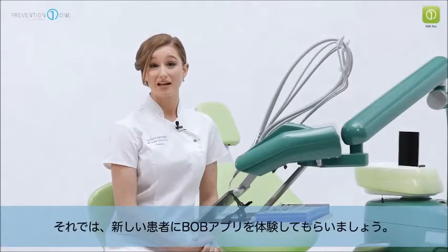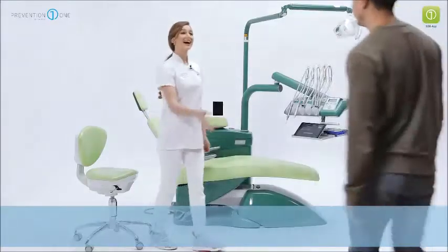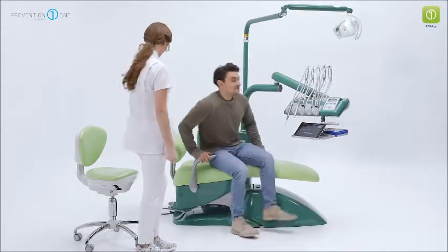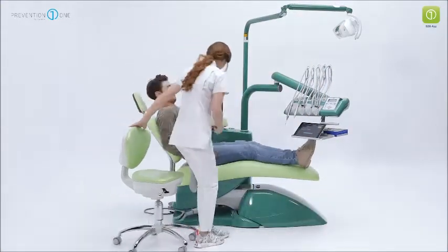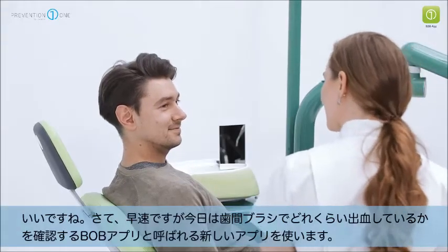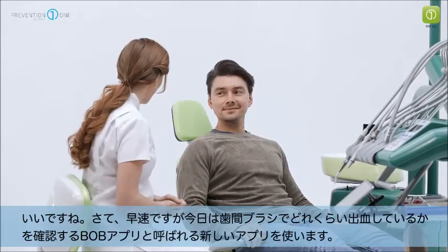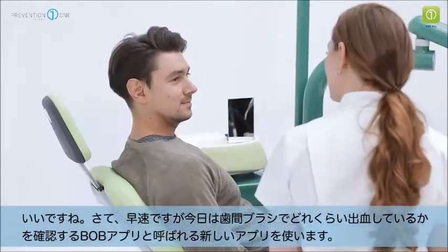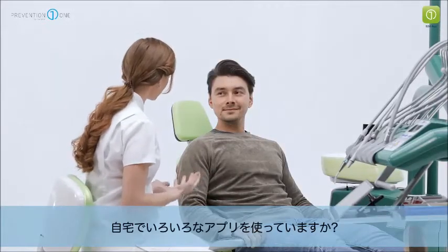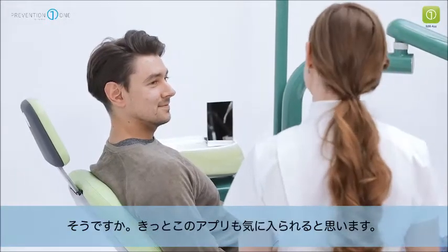So now I'm going to be calling in my new patient to start the new Bob app experience. Hi John, nice to meet you, please come and take a seat. How are you today? It's lovely to have you here and we're going to be using a new app with you today called the Bob app, which stands for Bleeding on Interdental Brushing. So we have gamified dentistry a little bit. Do you use apps at home? Great, so this will be quite exciting for you.